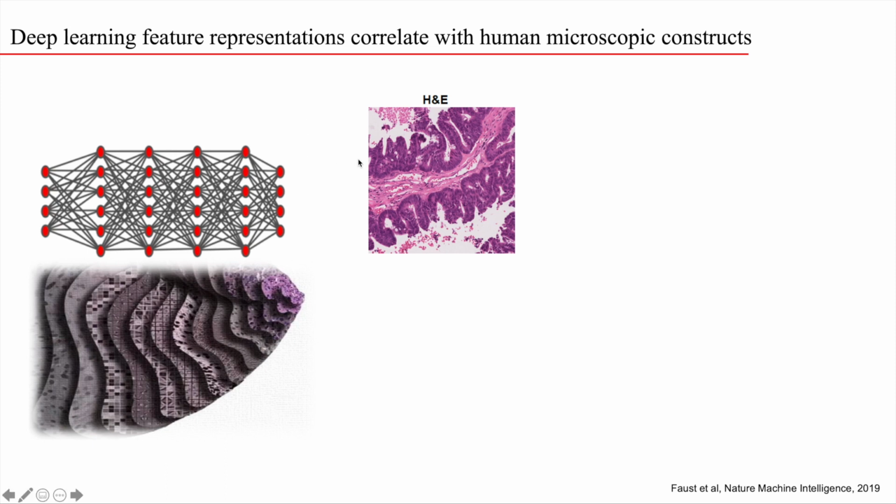So here is a metastatic colorectal cancer to the brain, and then we wanted to see if these neurons here are perceiving that there is a fibrotic component to this tumor, there is a papillary component to this tumor, and there is a kind of luminal structure that's also associated with these gland-like papillary structures.